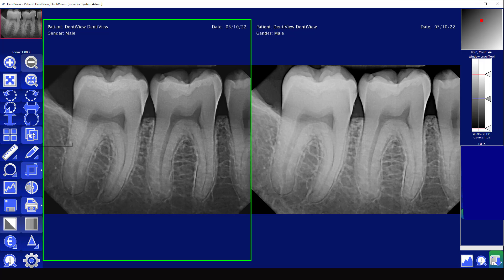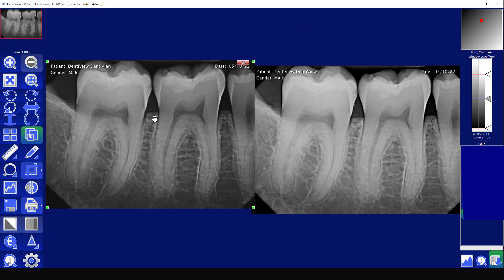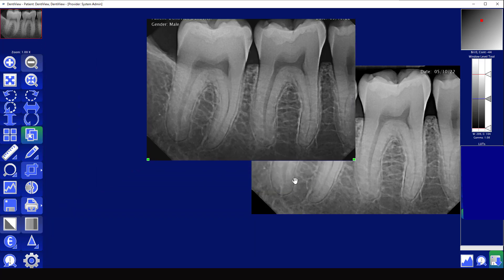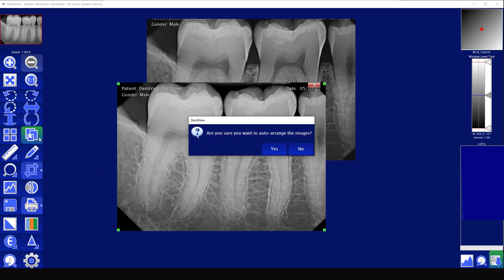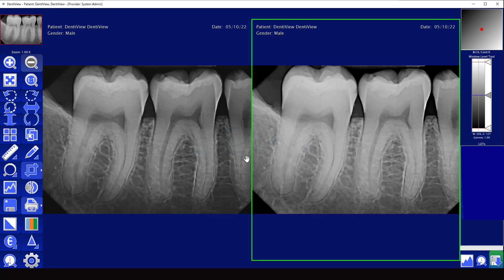Clicking on manually arranged images allows you to move the images anywhere you want on the screen. Once you are done you can close out, or you can have it automatically arrange them. The automatic arrangement tool will do its best to equally lay the images out so that they are very similar in size.